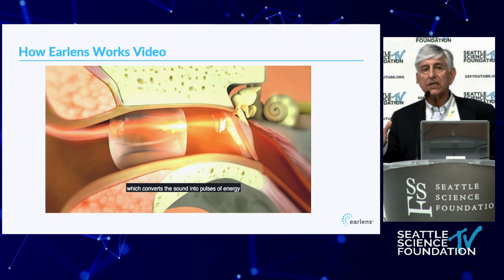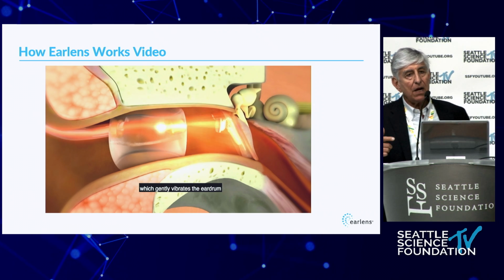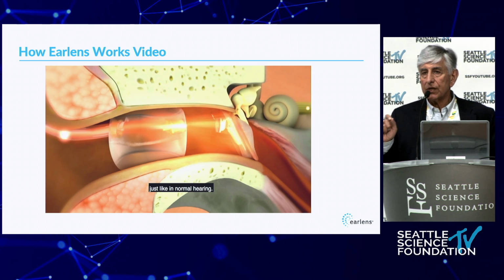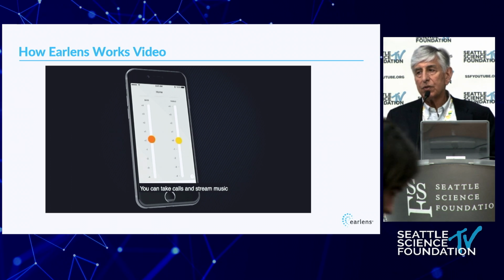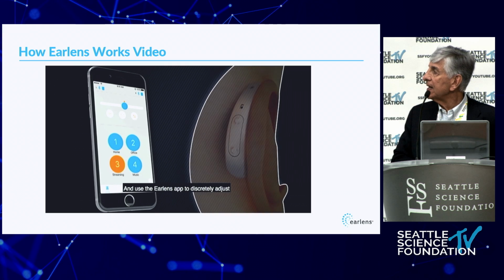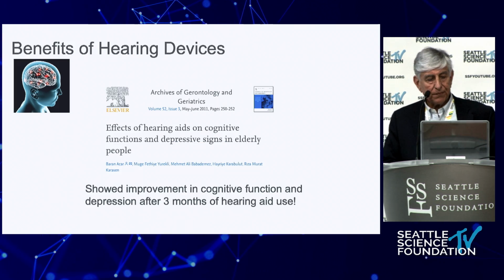And for whatever reason, and I can't tell you the physics of it, I can just tell you that the eardrum moving because of the plunger effect on the umbo, it just hears better than people that have an acoustic stimulation. And we have plenty of studies that show this. And then you have some external control signals that you can use.